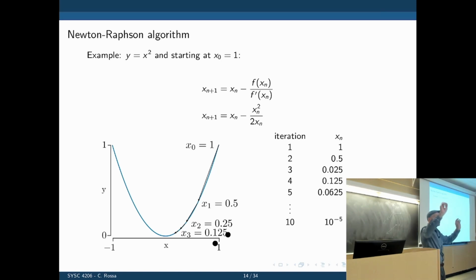How do we evaluate this cost function? Through the forward kinematics. We input values for the thetas in the forward kinematics and you'll know where the function leads to. So you can use the forward kinematics to evaluate the function. We can also add the constraint of the wrist, how we want to orient it. That would then be part of the cost function. Now the $1 million question: what's the gradient?